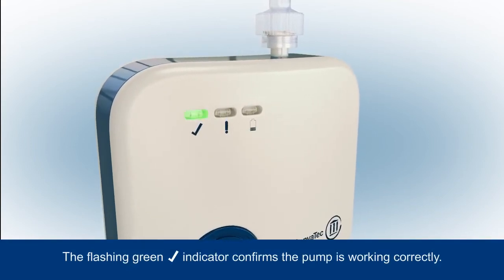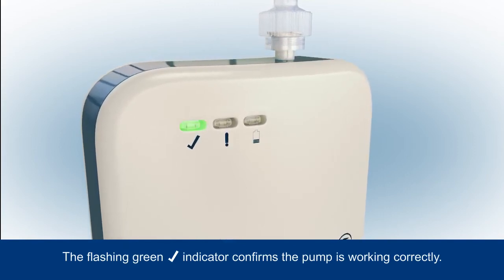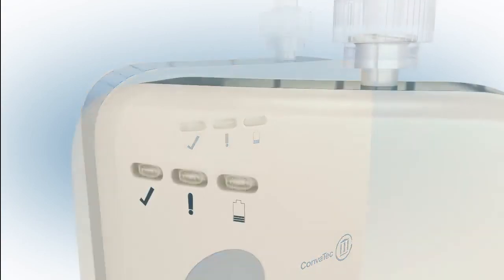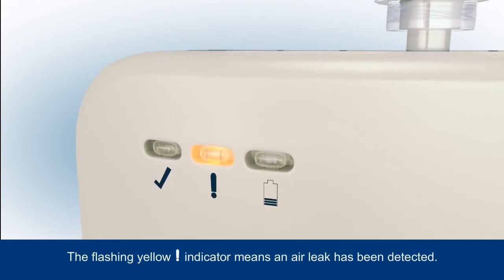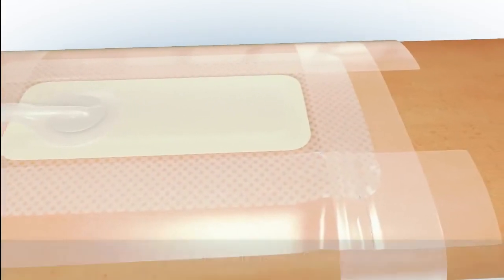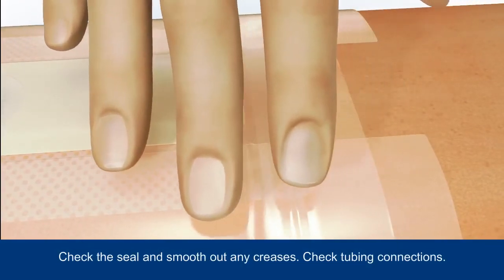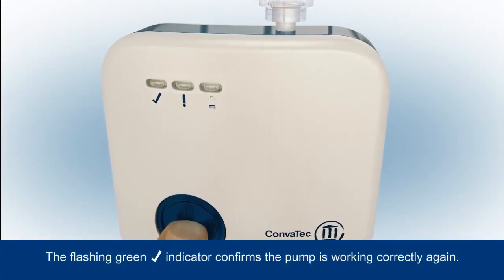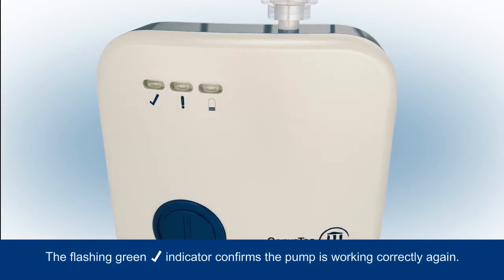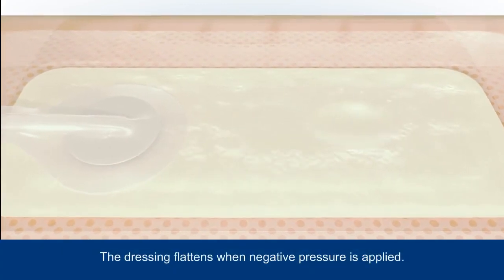The green tick indicator will start to flash to tell you the pump is working correctly, and will continue to flash regularly to indicate the system is on and functioning properly. If an air leak is detected, this will be indicated by a flashing yellow warning indicator. Ensure you check the dressing seal, smooth out any creases, and check that the tubing connections are secure, then press the blue button for three seconds to resume therapy.